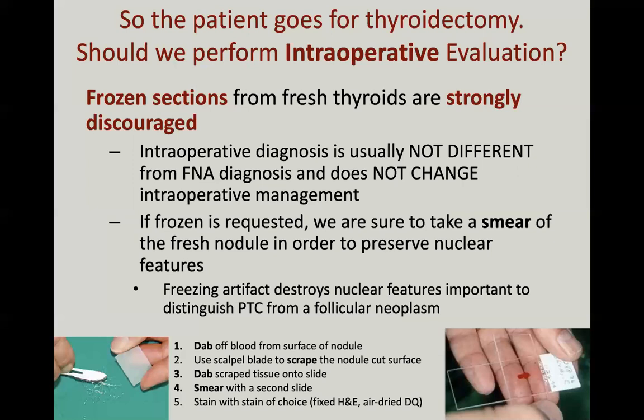The reason for that is because epithelial malignancies, even spindle cell malignancies, if you're dealing with a spindle cell lesion, don't just drop off the tissue like lymphoid cells do, right?